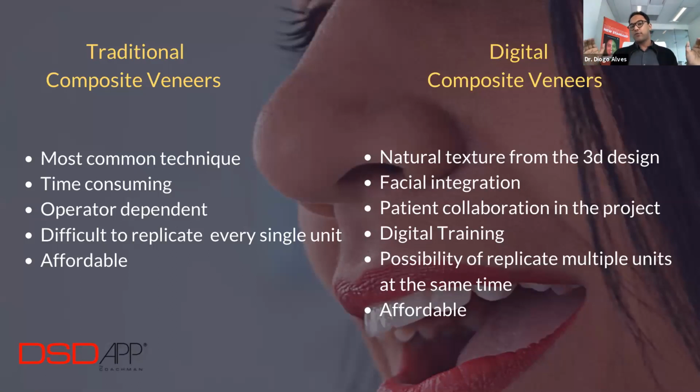So all that you will have to do will be polishing and finishing, which cuts a lot of time. It makes it shorter. Usually when I use the entire digital workflow, the procedure itself for about 8 to 10 veneers takes about 2 hours, which is not a lot, compared to 8 to 10 veneers done manually in this analog traditional way.